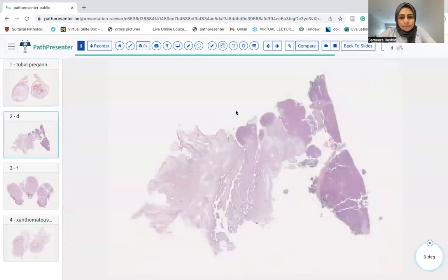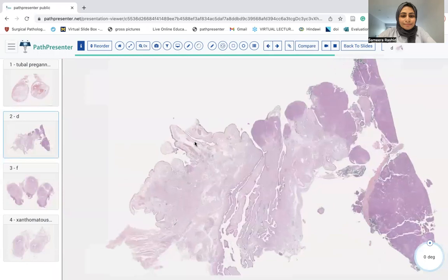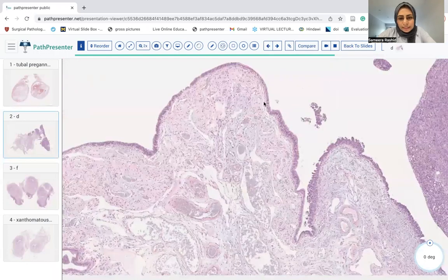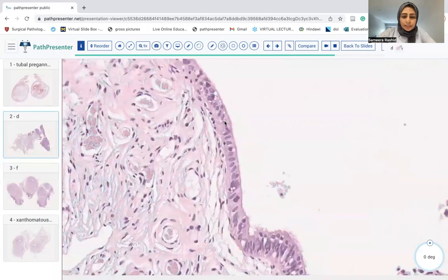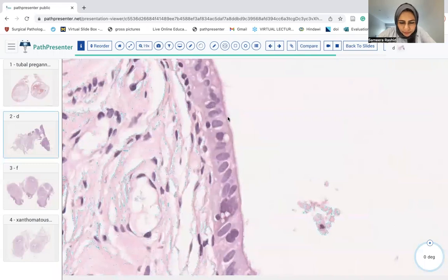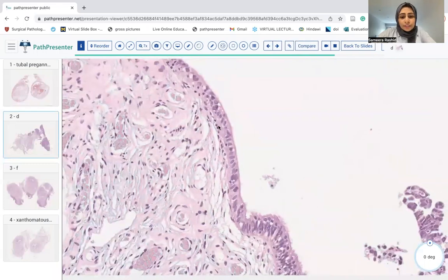Going to the second one. This is a section of the fimbriated end of the fallopian tube. If you remember anything from the last lecture, the only thing we are looking at the fimbriated end for is a STIC. So let's go high power — I have very nice, very regular fallopian tube lining, some cilia here, and the nuclei are orderly arranged.